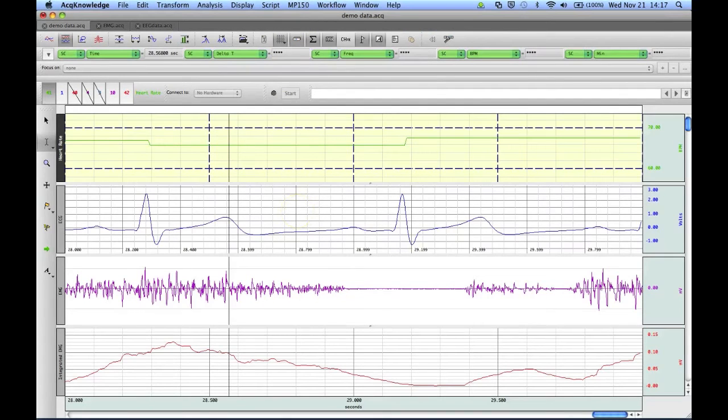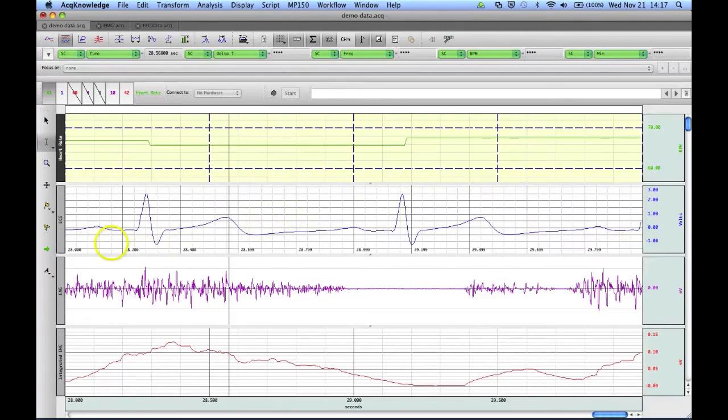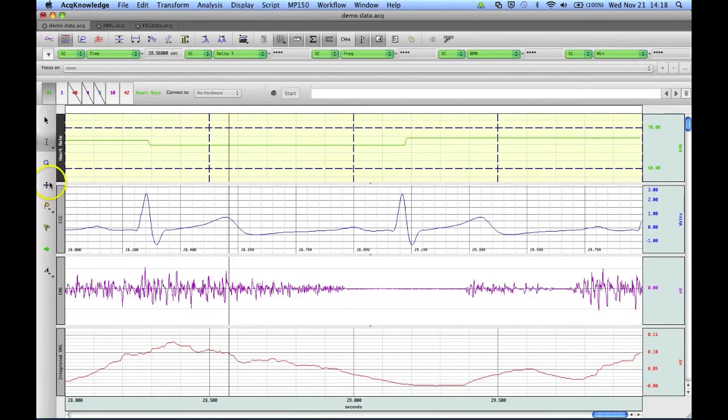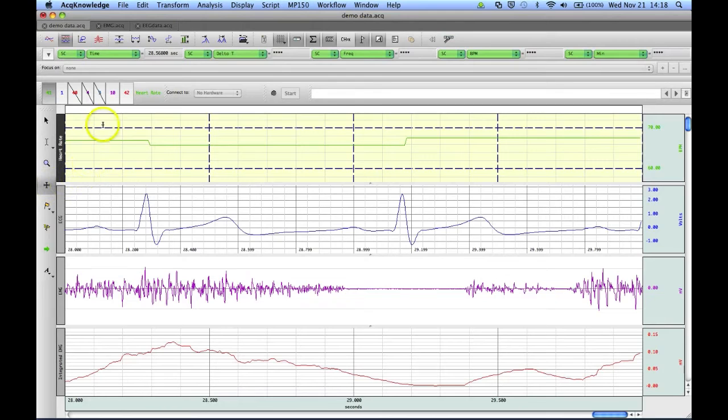Yet another way that we can change the grids on our graph is with the Grid Tool. The Grid Tool is located here on our main toolbar. If we click it, our cursor will then become the Grid Tool.